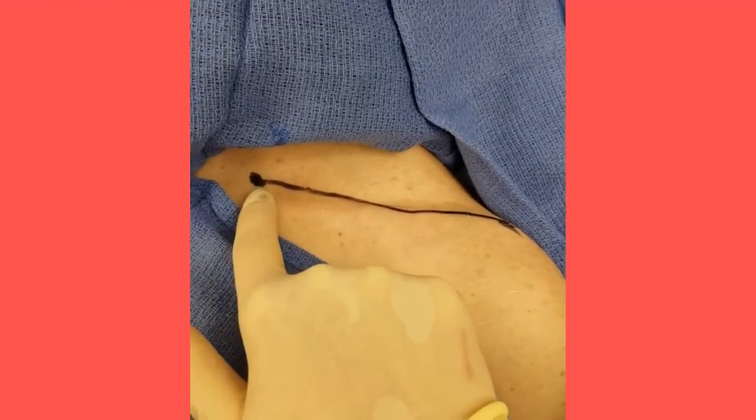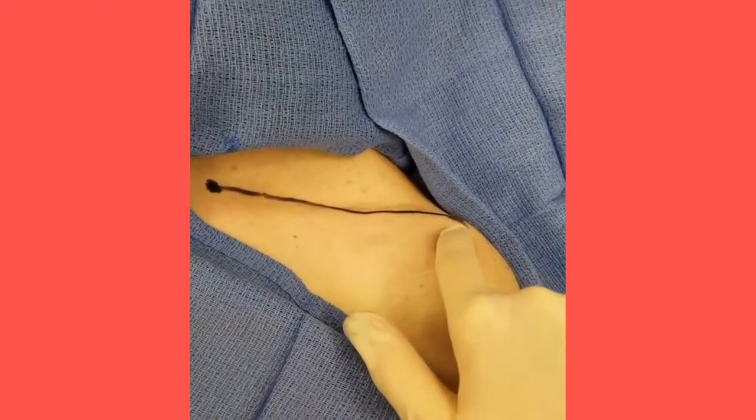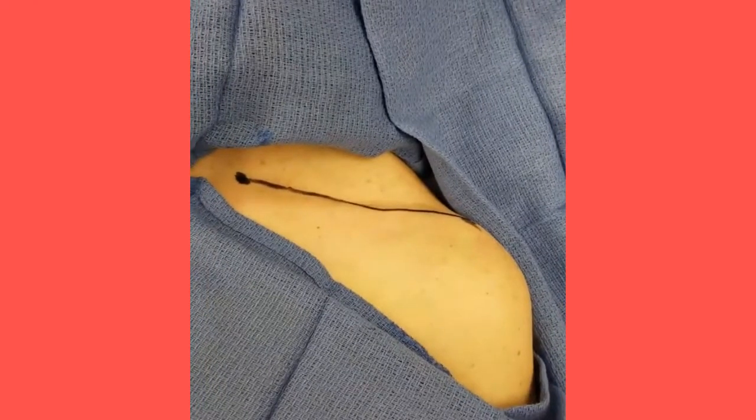For placement of the infraclavicular block, identify and palpate the sternal and acromial ends of the clavicle. Slide distal to locate the coracoid process, which is located in between the acromioclavicular joint and deltopectoral groove.